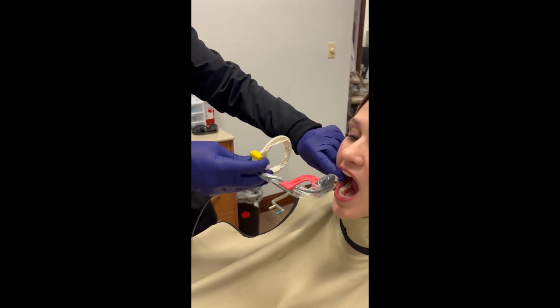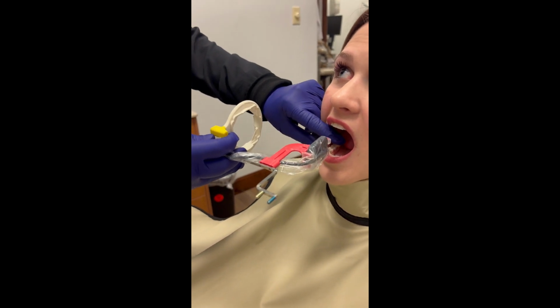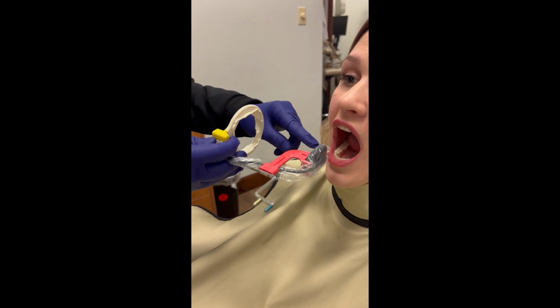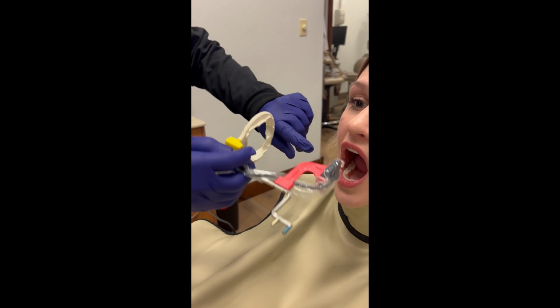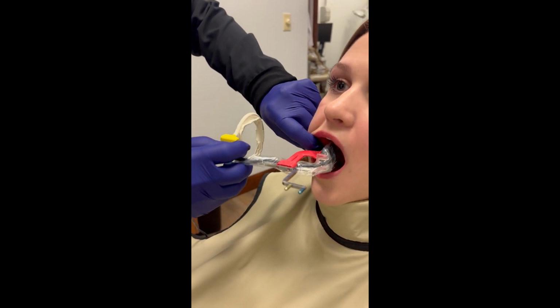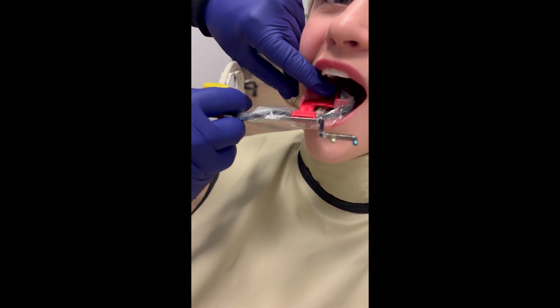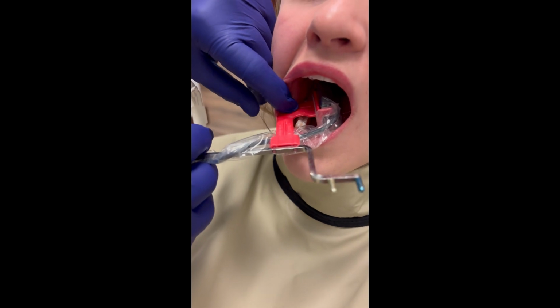When I'm placing my bitewing into the patient's mouth, I like to place it into the center of the mouth. If they have mandibular tori or palatal tori, or they have a very narrow arch, this can be challenging. So just do your best. I'm going to have the patient open wide, and I'm going to stick this between their teeth and their tongue. I like to tell them this is going to go between your teeth and your tongue, and I'm trying to go as far forward as I can.